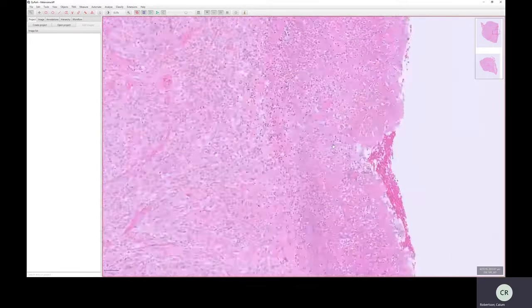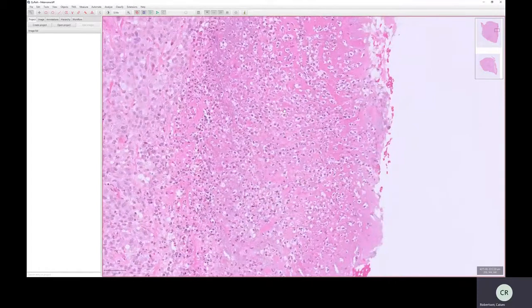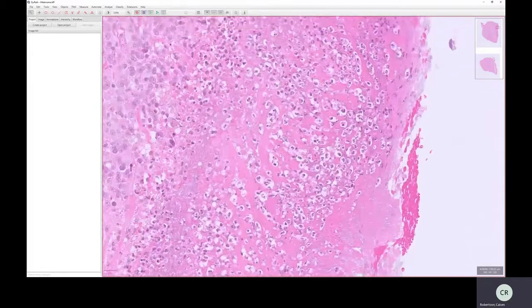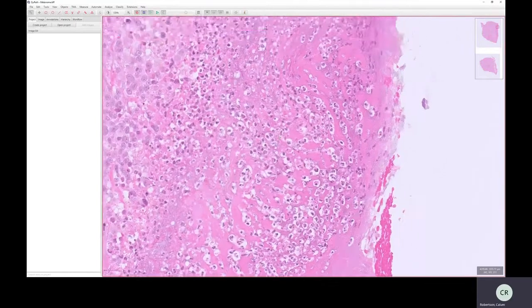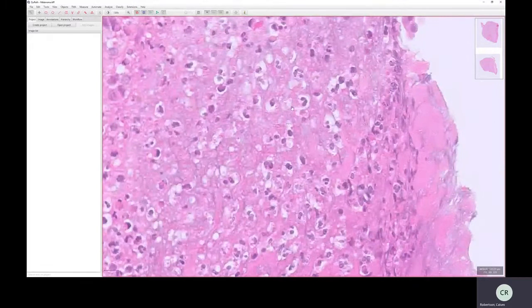The first was we couldn't find a good example of a neutrophil in the last section, but there's actually lots of neutrophils in here. There's lots of acute inflammation, and most of the cells here are actually neutrophils. What we're looking for in a neutrophil is the trilobed nucleus. See if we can get a good example. In this field, we've got a few that are probably reasonable examples. Here's one. This is one cell, and this nucleus has the 3 lobes to it. This is 1, this is 2, this is 3. You can see this nucleus because it's picking up the hematoxylin stain. It's looking purple.